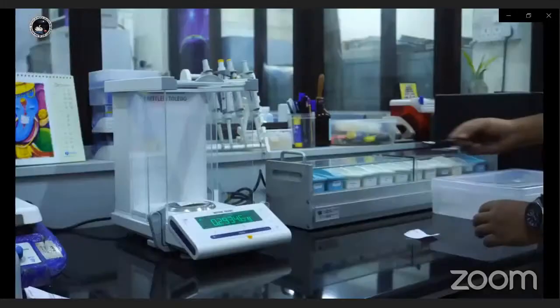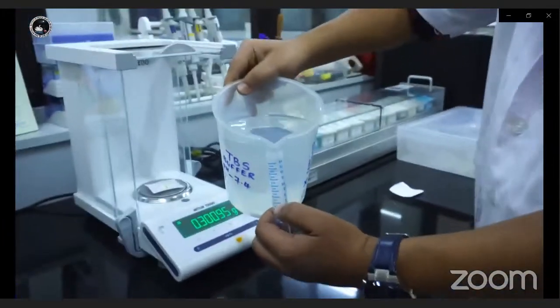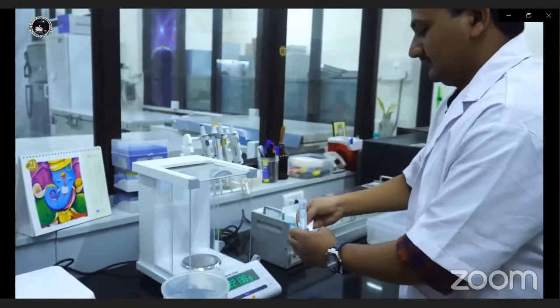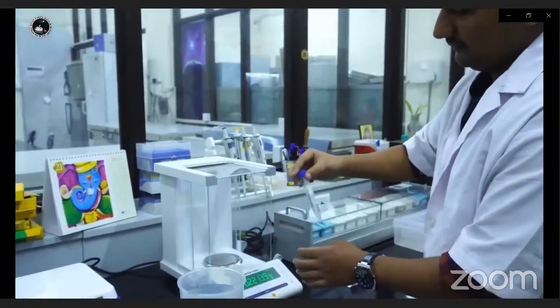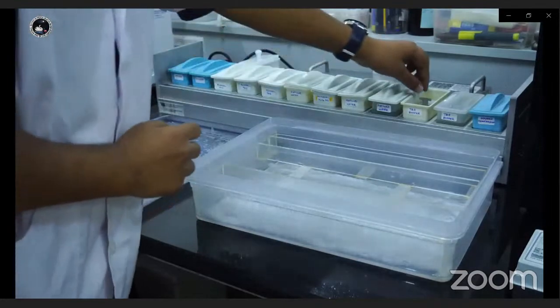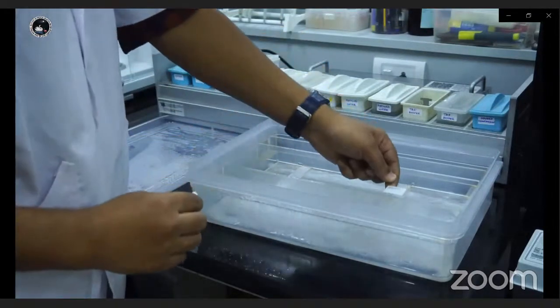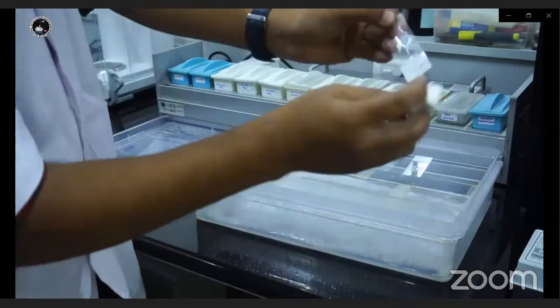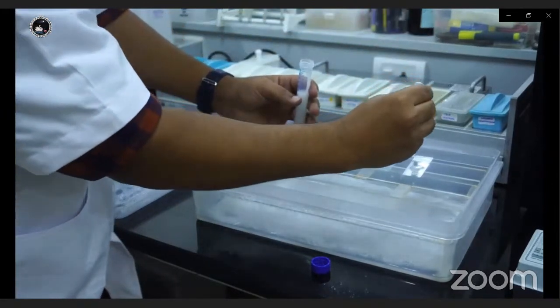The next step is protein block, which is important for preventing background staining. For this, we use freshly prepared 300 mg of skimmed milk powder dissolved in 10 ml of TBS. Leave this for 30 minutes for it to completely dissolve. It's good to prepare 30 minutes before using. Place the slides in a humid chamber in order to prevent drying artifact. Apply protein block for 30 minutes.